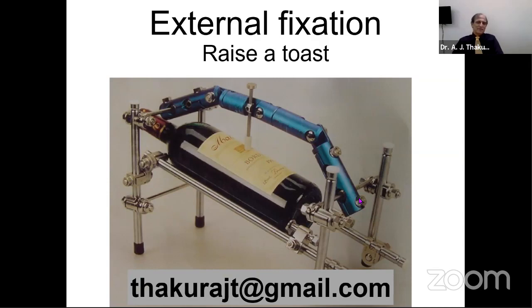Right. But sir, in those cases, can we manage them on external fixator only, or should we go to another modality? Your experience? See, long-term management on the pin and clamp fixator is difficult. One would like to switch on to something else as a choice. In the ring fixator, this is possible.